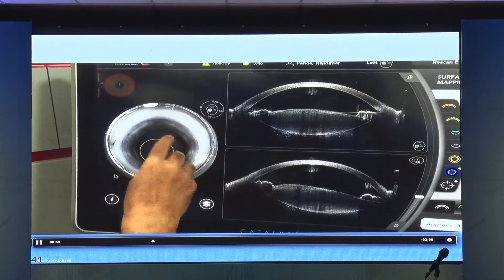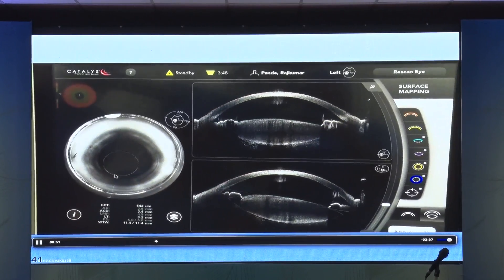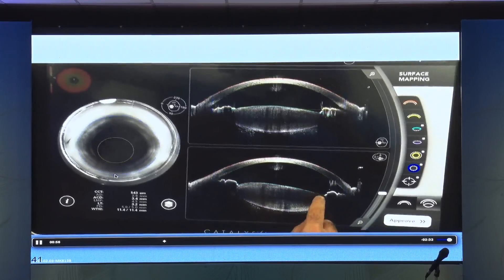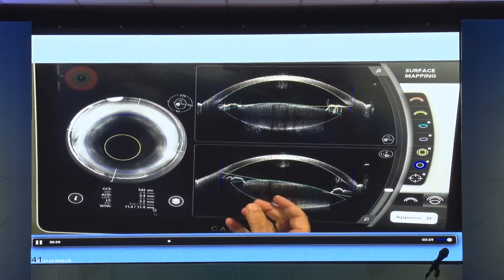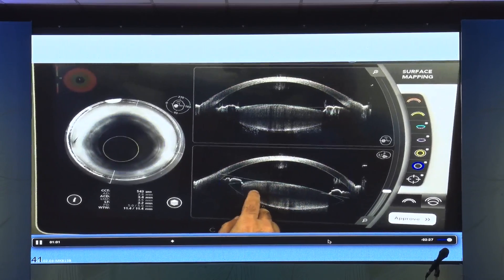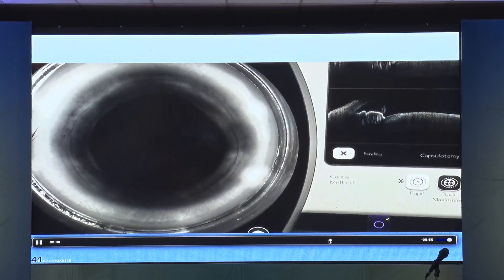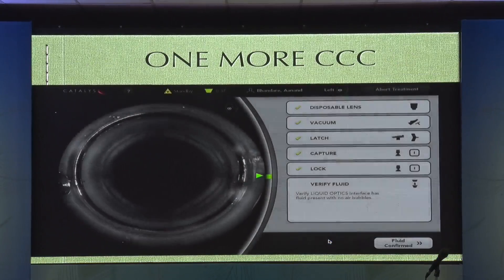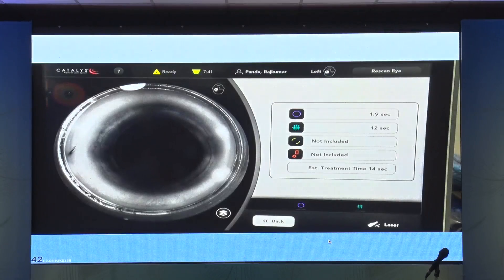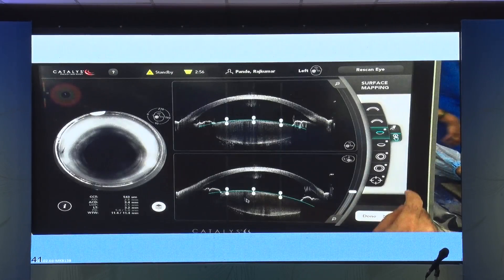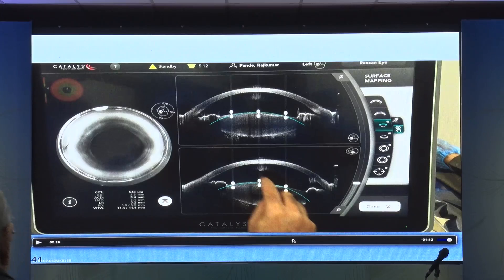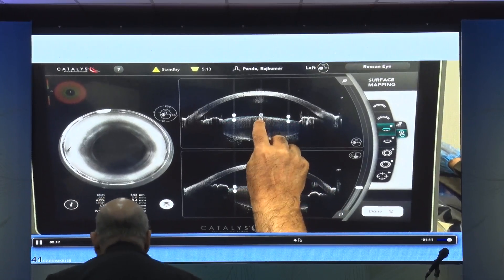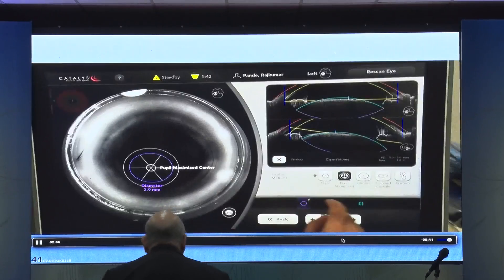So this is where the subluxation is and this is what I'm doing. Once you freeze everything and get a level, go ahead. You can see the tilt. At the end of the procedure, I got a 3.9 millimeter CCC. There was some discussion as to how it can be a 3.9 millimeter CCC — that was a mistake I had made. But it can happen because it was my first case. Now I've got better with it.